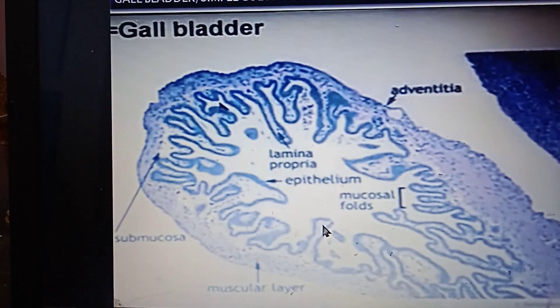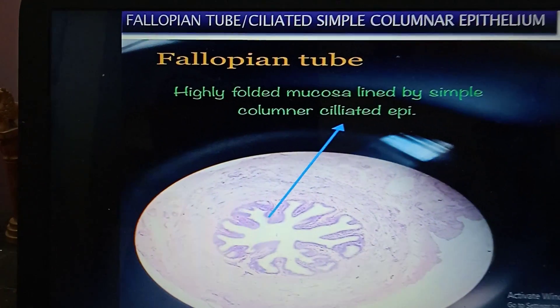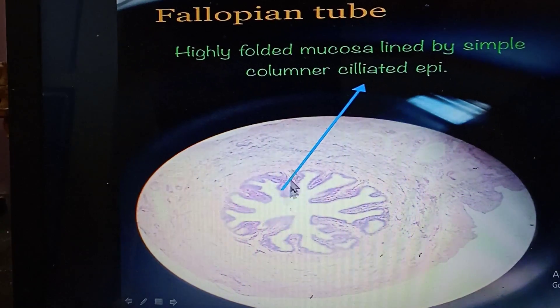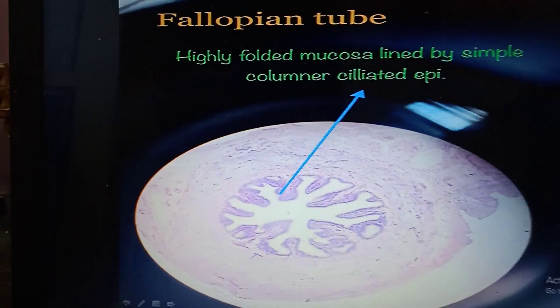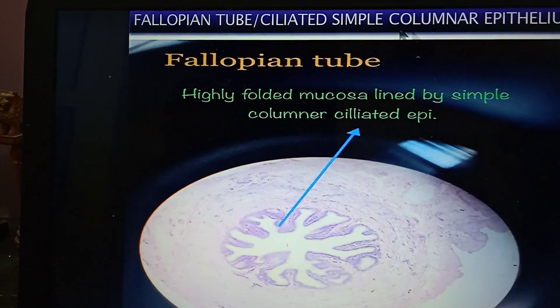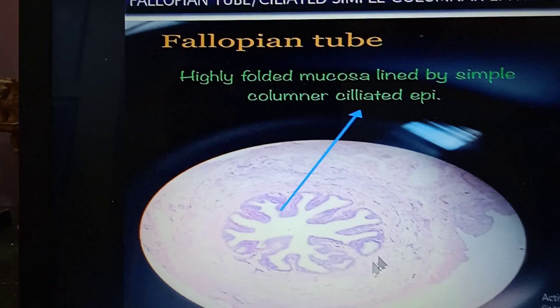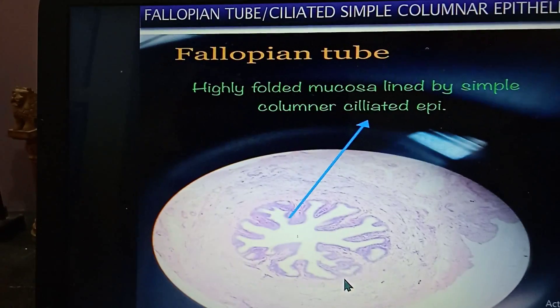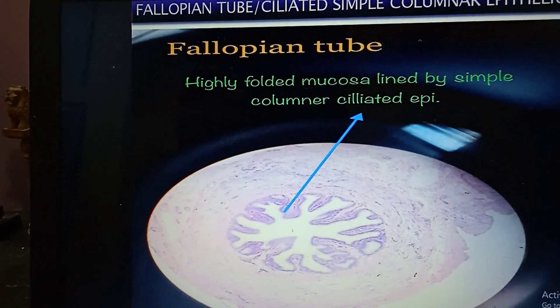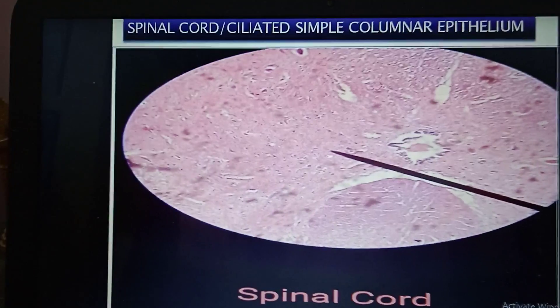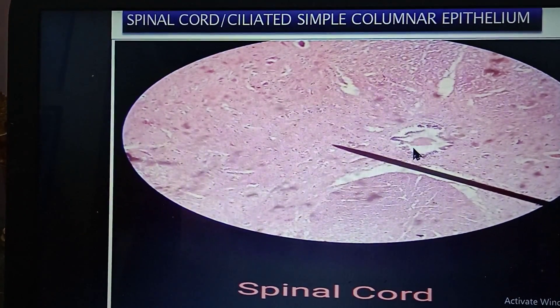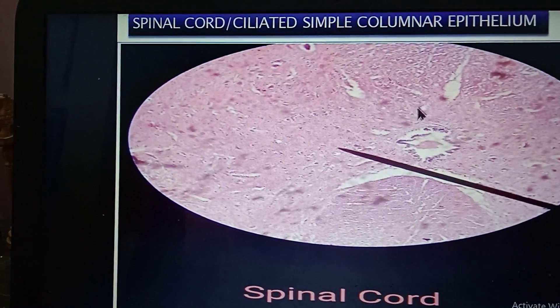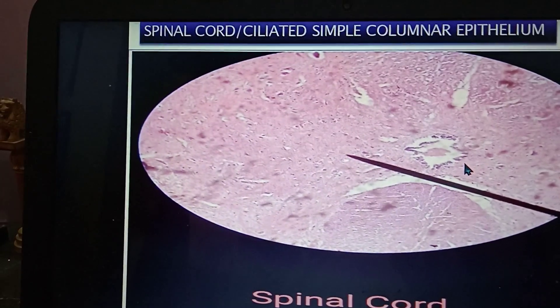This is the fallopian tube, which looks like highly folded mucosa lined with simple columnar epithelium. You have to write ciliated simple columnar epithelium for the fallopian tube — it is highly folded mucosa having ciliated as well as non-ciliated columnar epithelium. This next slide is also ciliated simple columnar epithelium: the central canal of the spinal cord lined with ciliated simple columnar epithelium.